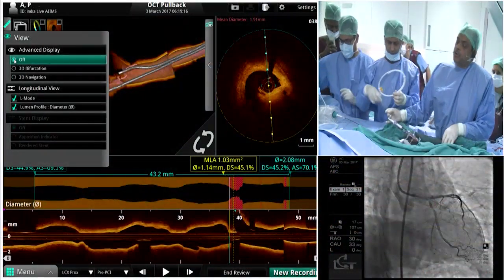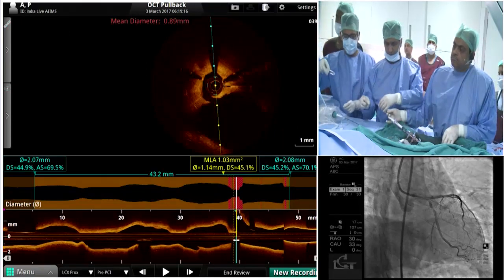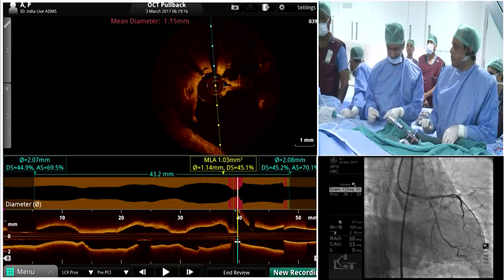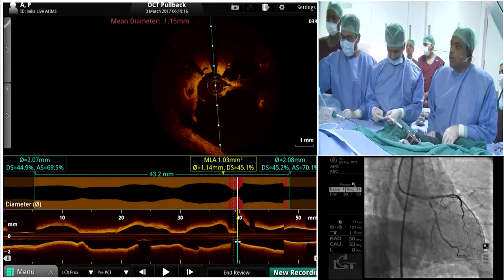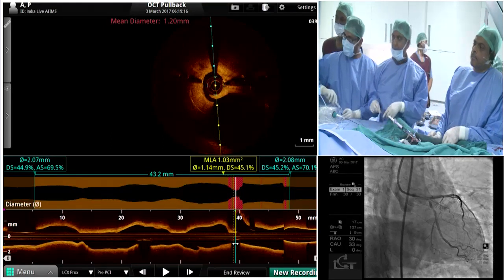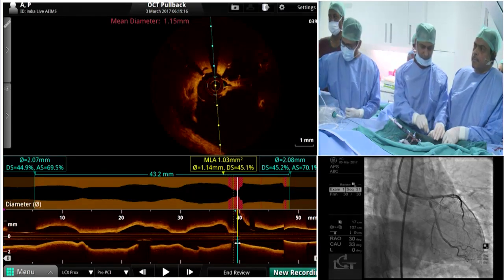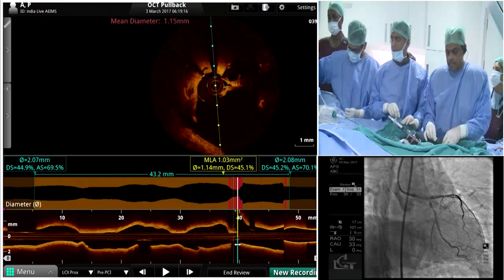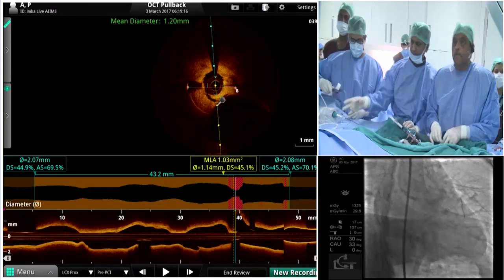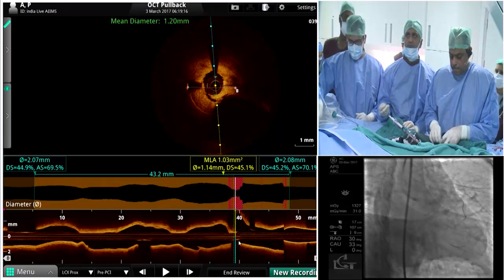So if I ask you a question, how has the OCT helped? Has it helped anyway? In this case, it was very complicated because it's not a fresh stent, but we have a lot of tissue around, so we cannot derive exactly the geometry of the cells. I think the point is that the space that we were opening in these cells remains very limited, and that is probably linked to the closed cell design.